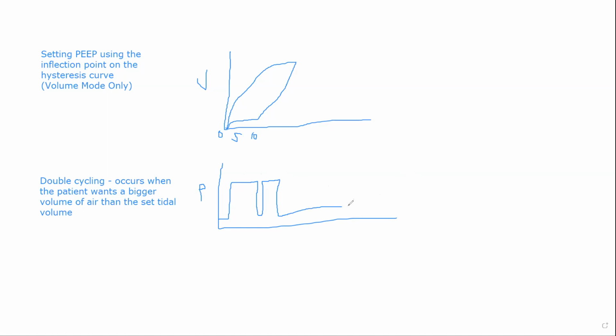And then in volume, the volume is climbing. And then another volume goes in and then they exhale. So I don't think I drew that right. It's like one and then another right after it. I don't get a choice to erase.